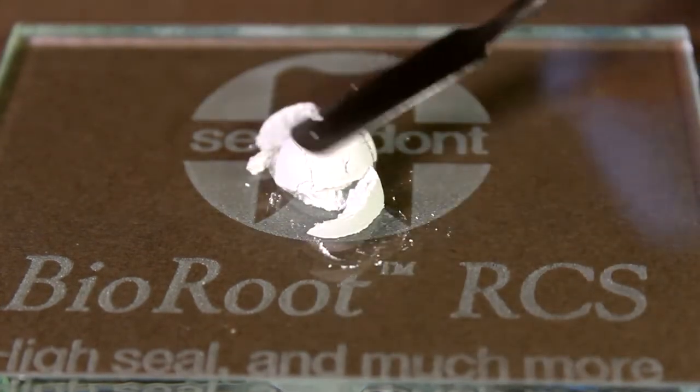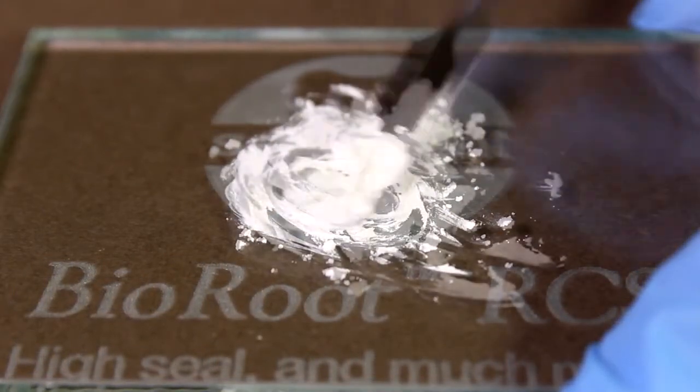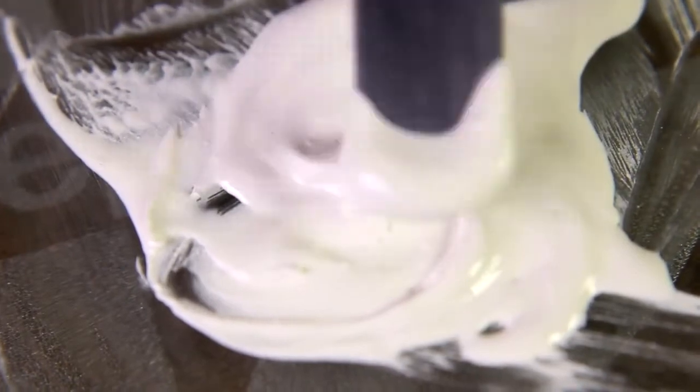Prepare the root canal sealer by progressively adding powder to the liquid. Gently fold until it becomes a smooth paste for approximately 60 seconds. Immediately rinse and clean the instruments to remove any residual material.